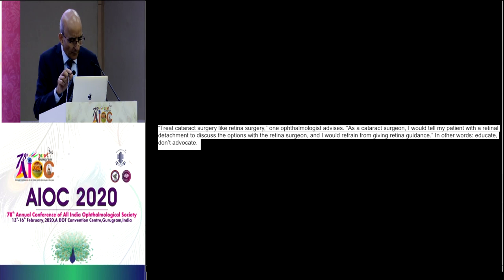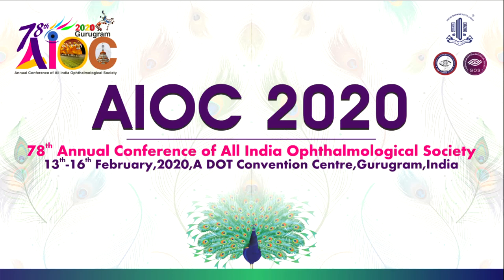I think the point is that with this cataract refractive surgery, we are able to make patients happier than earlier, but there will be patients where we have to avoid putting these multifocal lenses if their ocular profile is not good, their corneal profile, their hobbies and their demands are such that you need to be very careful.